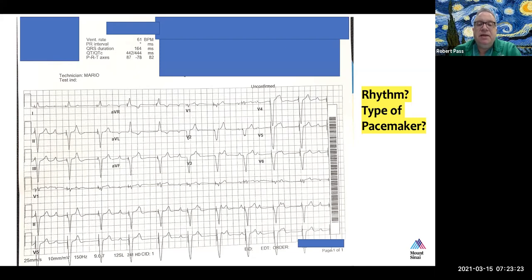probably the better. And so my general approach is that if I have a patient who has two ventricles, does not have a lot of AV valve regurgitation, has good heart function, if the surgeon would prefer to put in a single chamber pacemaker, it would usually be my preference to put in a single chamber pacemaker, because patients do extremely well like that in general. There are rare patients who develop dysfunction, but it's unusual. So I just thought I would go over that little point today.